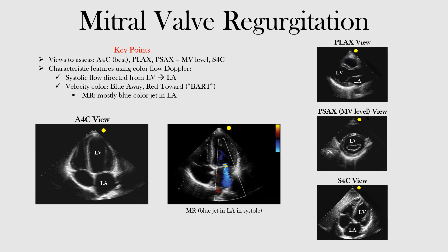The best views — if you recall from mitral stenosis — included the parasternal long axis view, where we could assess for calcification, thickening, or doming of the anterior leaflet. For mitral regurgitation, the apical four-chamber view is a great one. Here we can see all four chambers: the left atrium, left ventricle, right atrium, and right ventricle. Our focus is the left side, because the mitral valve sits between the left atrium and left ventricle.